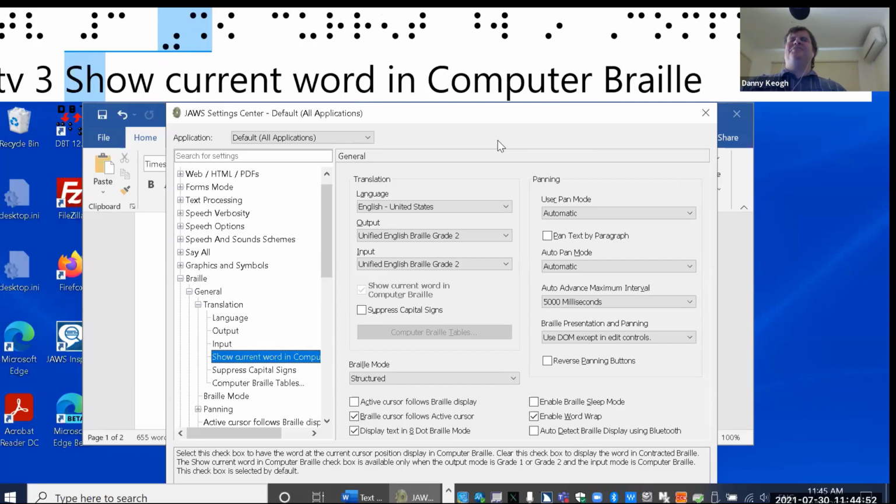And there's another option further down where you can turn off underlining, because one of the things I did neglect to mention before is that all of the cells on these Braille displays have 8 dots instead of 6, because the bottom 2 dots are used for things like the cursor and also for underlining text, which you are able to do. Now, some people have no trouble reading text when it's underlined. I don't particularly like it, so it's something I do turn off. And of course the most important one is to look for the option that talks about status cells and turn that off as well.